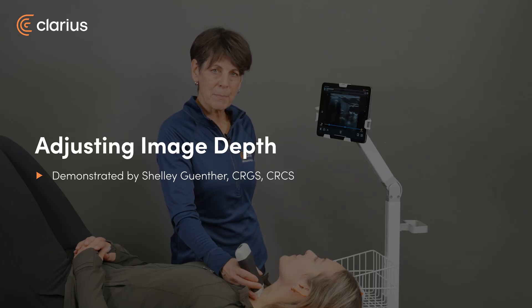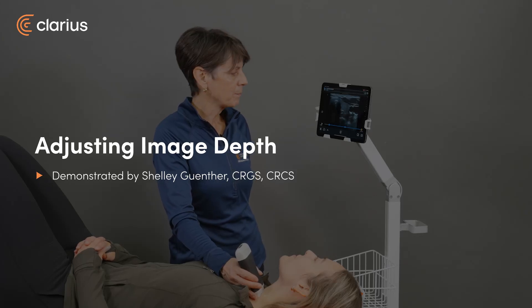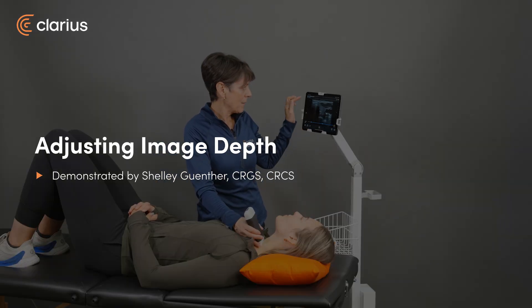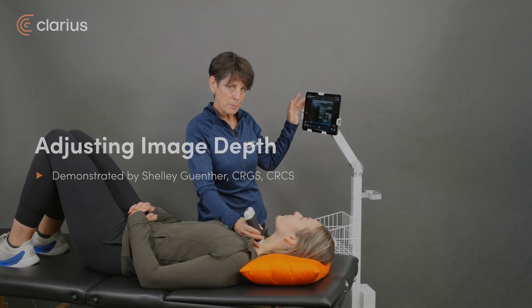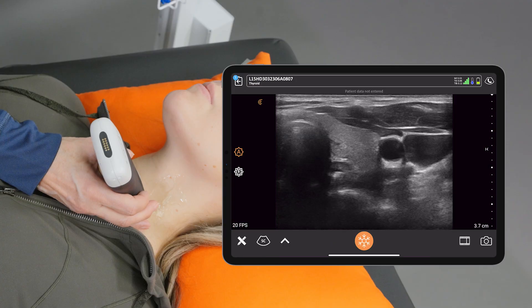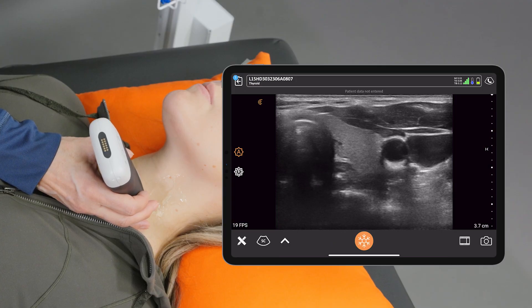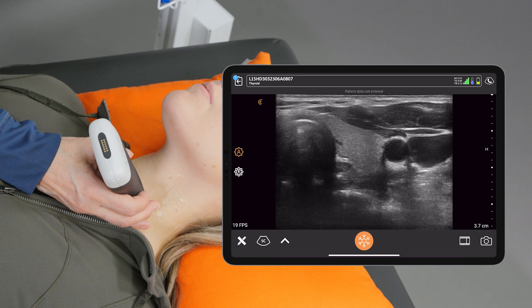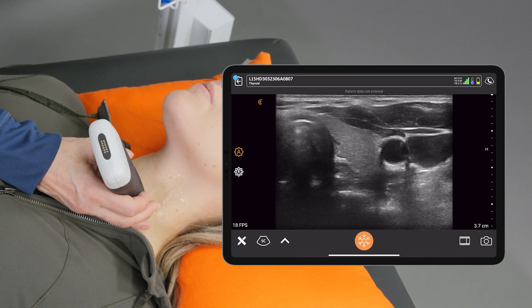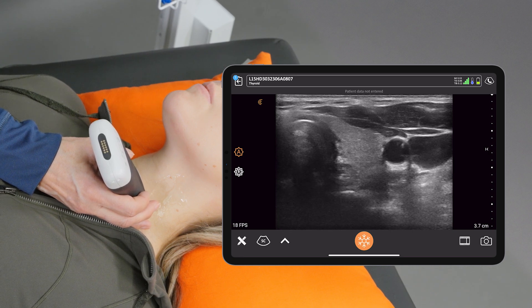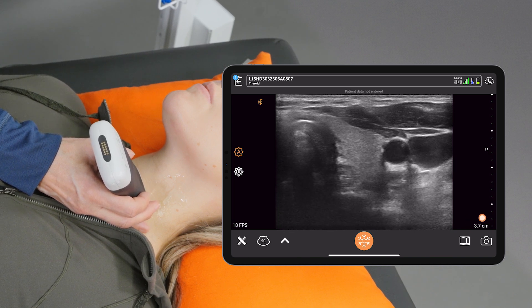Let's talk about depth. I'm using a linear scanner on my model's neck with the thyroid preset, and you'll notice that my maximum depth — the maximum depth I can image with my current settings — is at 3.7 centimeters.